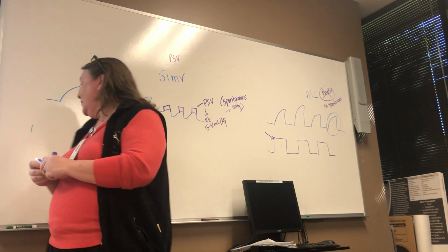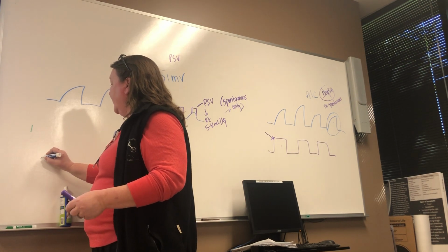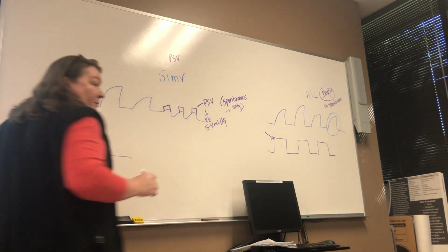Pressure regulated volume control. First time I hear that, just letting you know. Say that again. You did not say anything about this before. So let's do this. Ms. Foss, can you say that again? You said you set the max pressure. Yeah, I'm going to say it again right now.